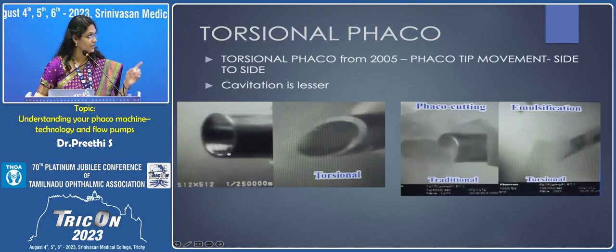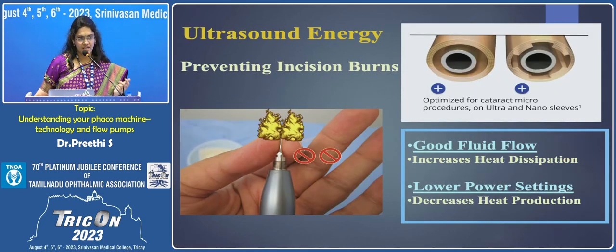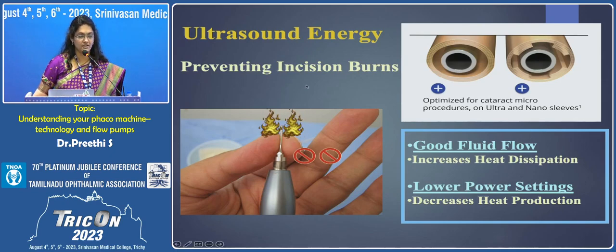If you see closely how it vibrates, the longitudinal will have a forward and a backward movement. The torsional will have a movement sideways. So in longitudinal, as I said, you cut when you go forward and then you aspirate when you come backward. But when you come backward, there can be a little chatter effect in the longitudinal. But the chatter effect is less and it is more efficient in torsional. So the side effect will be, heat is generated, so you have to prevent the incision burns.